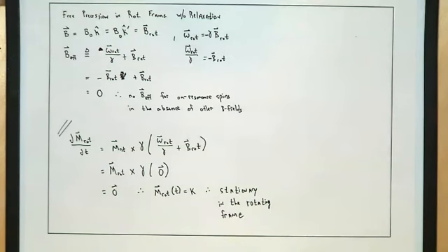So not an especially interesting result, but hopefully one that makes sense to us now. Meaning, if we want to describe free precession in the rotating frame, there's nothing to observe. There is no precession anymore because we've effectively demodulated it with the introduction of that so-called fictitious field. Questions about that?